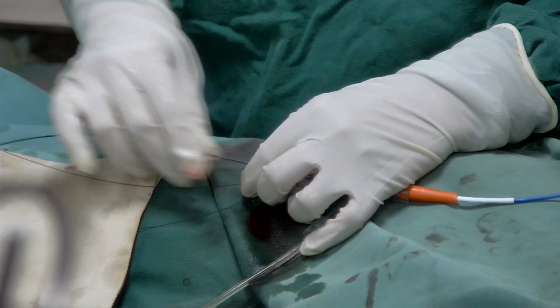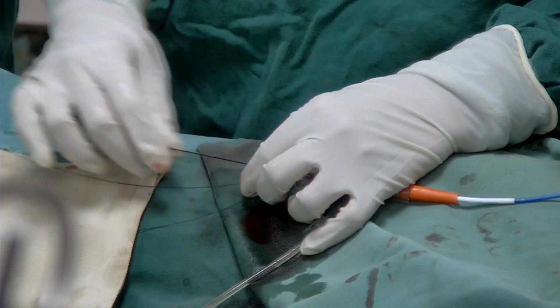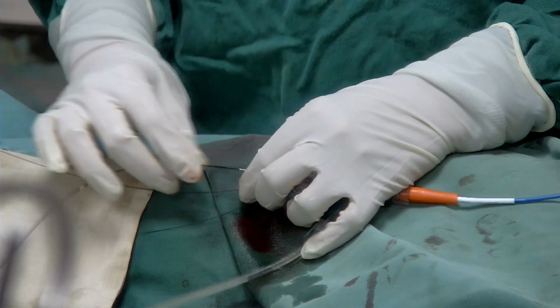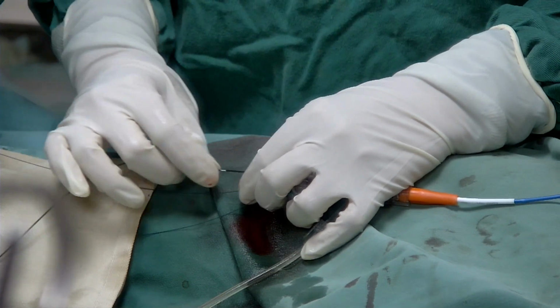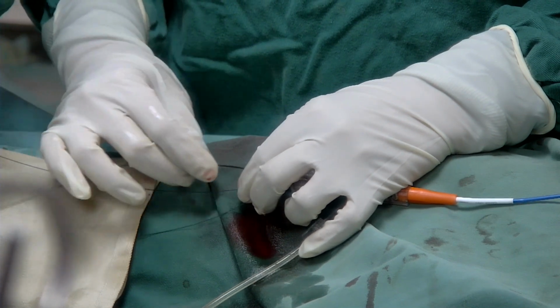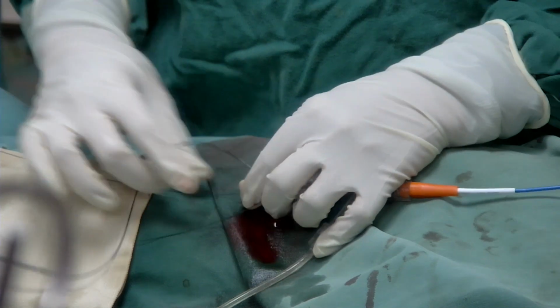Now we are in and we push our catheter in. Oopsie.